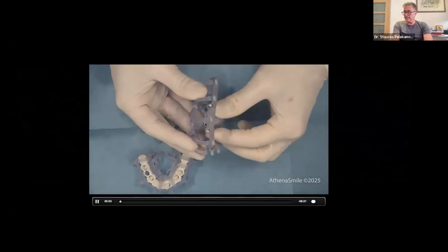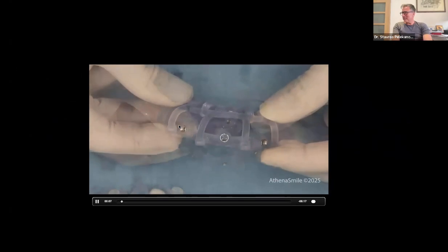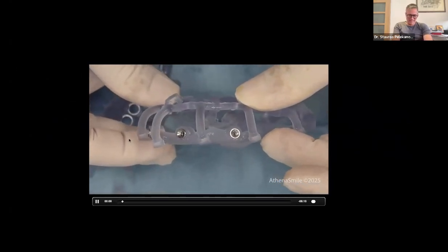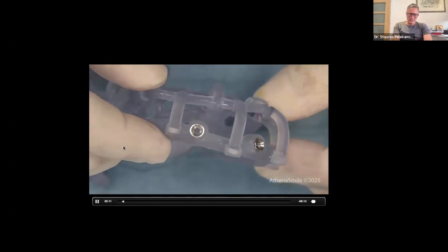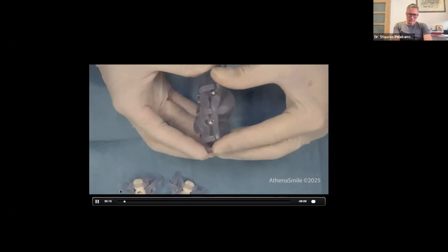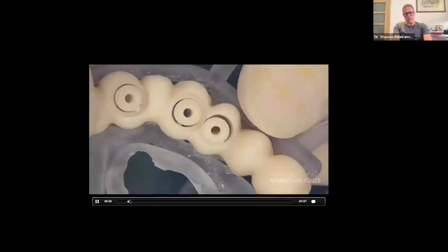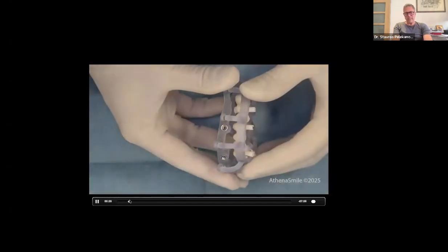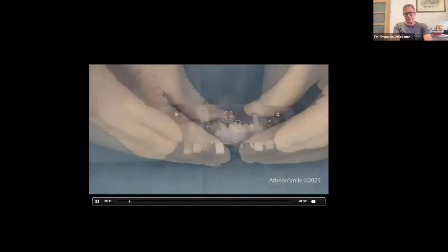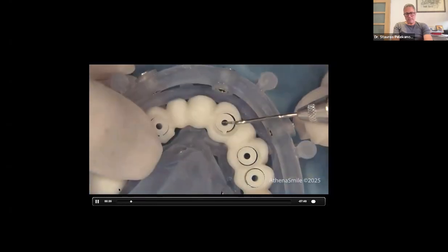here we see the Vensi just opened the door. So here we see some parts of the surgery. So again, stackable guides, and this is the flex fit. I will have to run the video a little bit.